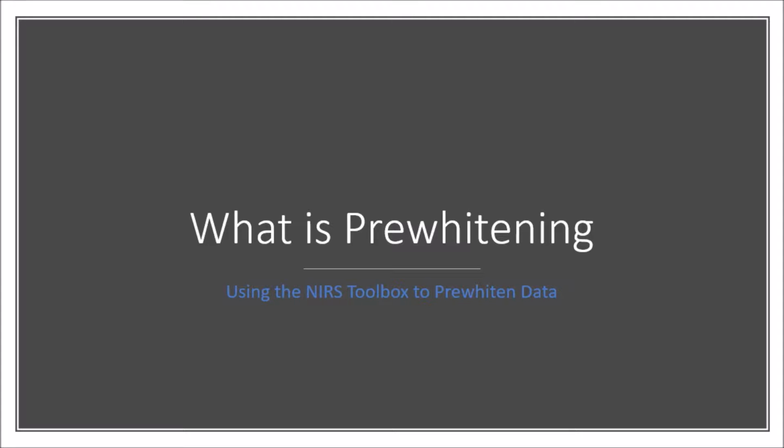This video is going to be a quick one about what pre-whitening is, specifically how it's used in NIRS and actually in the NIRS Toolbox.